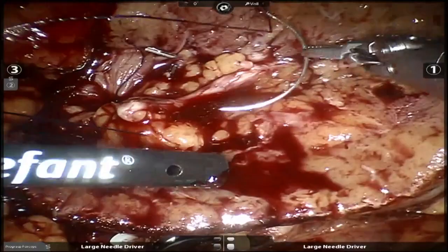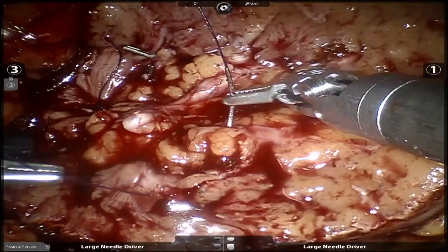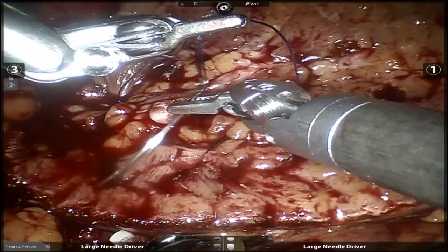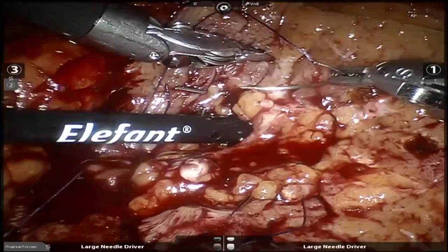Suck in here, Brando. Show me. Give me another stitch, Brando. 15, yep. Bring it in while I'm doing this. Drop it, drop it. Suck right here. There's another calyx right here. There it is. You see it?